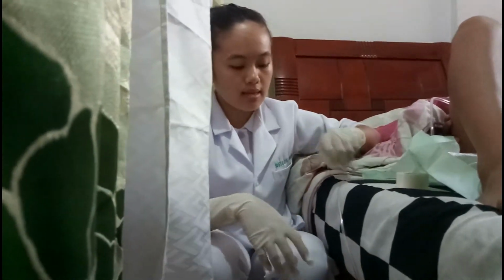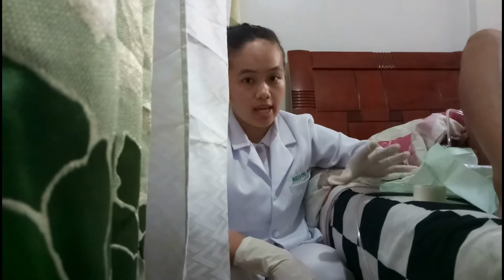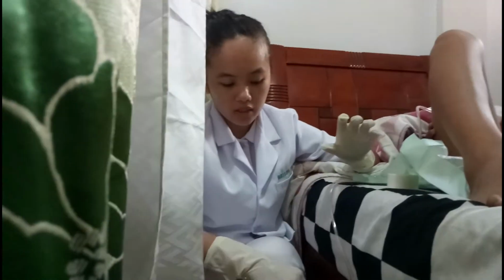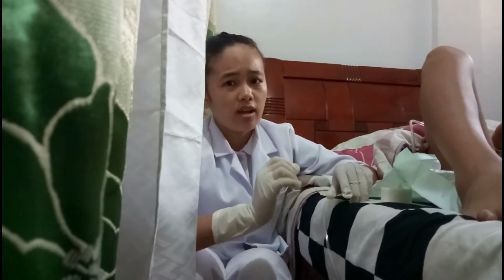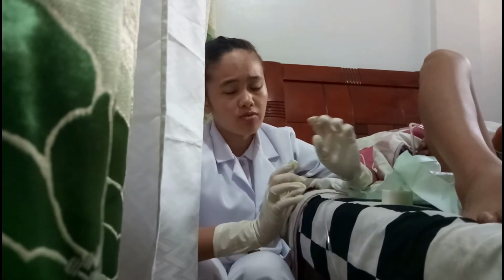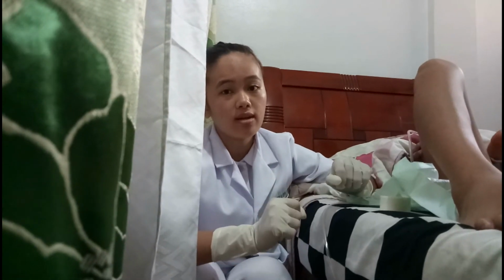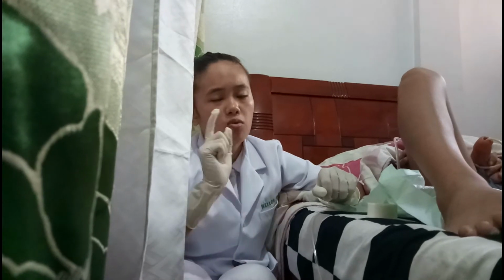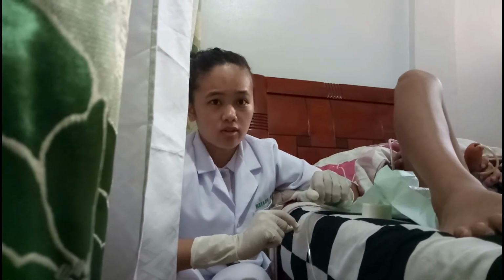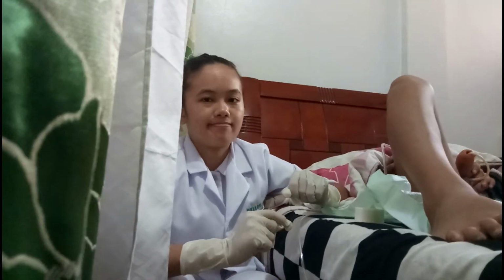So as you can see, this is below the level of the patient's hips. If you place the urinary bag far from the patient, not below the level of the hips of the patient, it might cause backflow of the urine and it might cause retention to the patient. So we must avoid that in order to secure the safety of our patient.